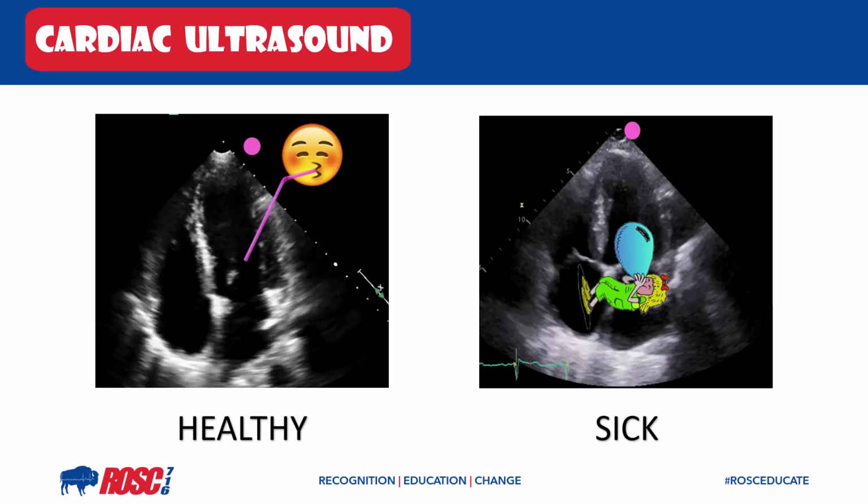To do that, we would have to increase our ultrasound knowledge to include diastology. Diastology is the understanding of the diastolic filling of the heart, the relaxation portion of the heart. If you think about it, a healthy heart appropriately relaxes and facilitates early ventricular filling during diastole, a suction effect, if you will, as the left ventricle relaxes and actively fills and suctions blood from the atrium.